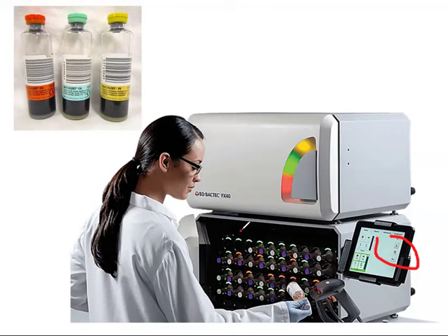After that, let's just wait for how many days to see if it turns positive or negative. Usually, the reporting for this, class, is after 5 days. Okay, but on that part, on checking if it's positive or negative, it's not the task of the phlebotomist anymore. It's the medtech in the microbiology area of the lab.